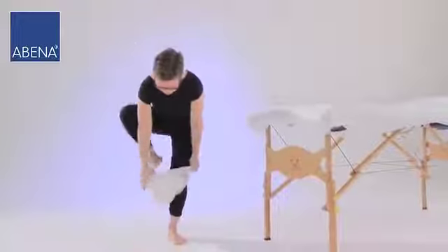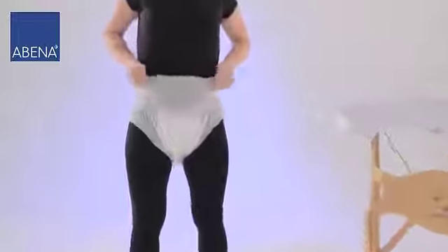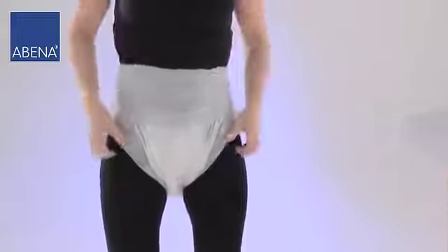Put on the AbriFlex as if it was normal underwear and make sure it fits properly in the groin area. Check the edges for a proper fit.